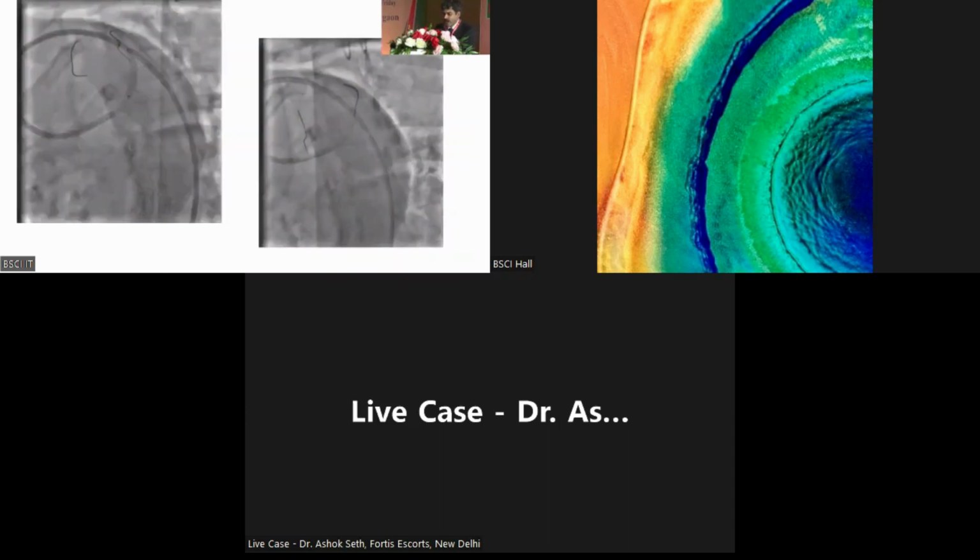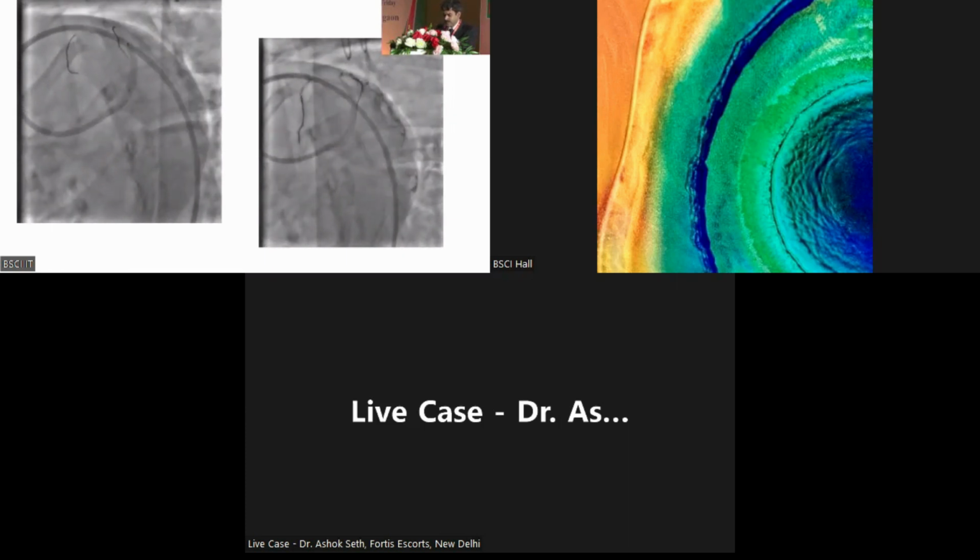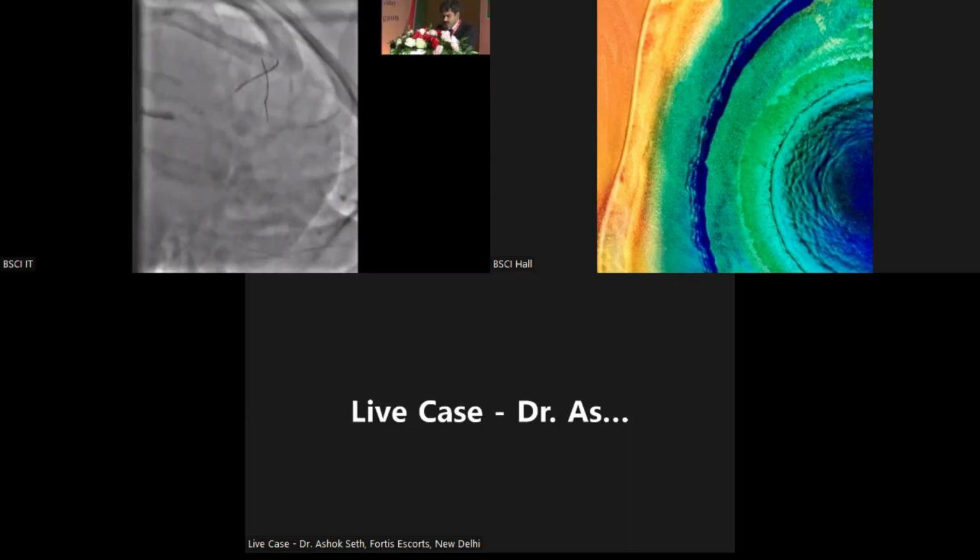And what I saw after placing the stent, the main vessel stent had been pulled a few millimeters into the left main. It is in the left main. So you can appreciate this, and the circumflex stent, which is not exactly distal to the circumflex ostium, was perhaps in the left main also, and there's a crushing of the left main circumflex stent. You can appreciate there's a small crushed segment.